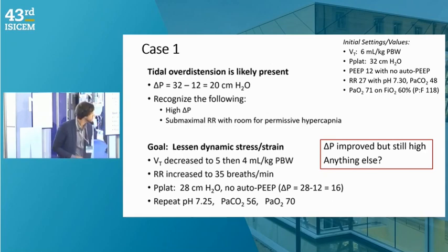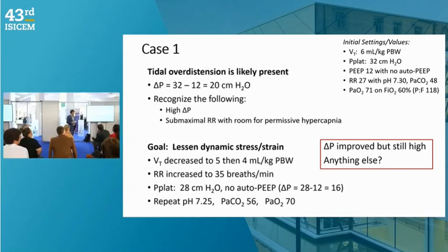Yeah, I've got a question. You've decreased the driving pressure in the tidal volumes, but you've increased the respiratory rate. So how do you know if you've actually improved things or made things worse? Because you're giving less volume, but more often.